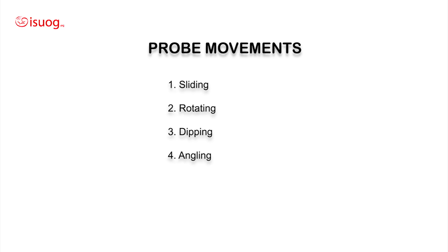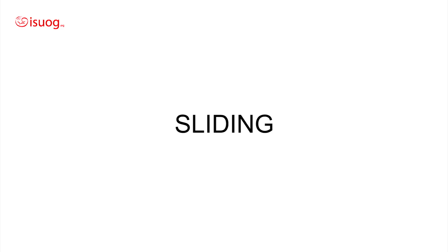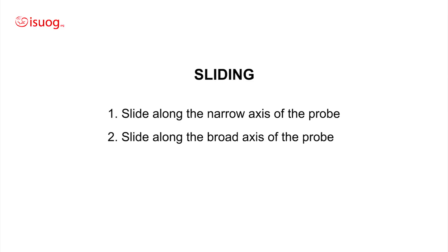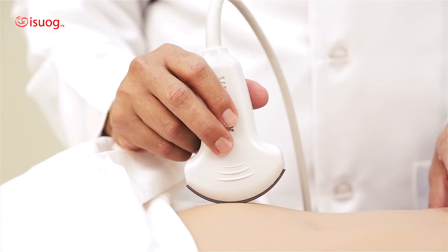The first probe movement I am going to demonstrate is sliding. There are two movements in sliding: the first is sliding along the narrow axis of the probe, and the second is sliding on the broad axis of the probe. I am going to start with the first one — sliding along the narrow axis. During my demonstration, I am always going to refer to this part of the probe as the narrow aspect of the probe.